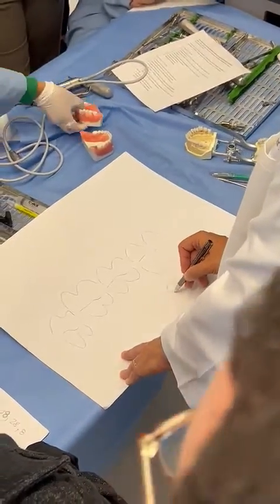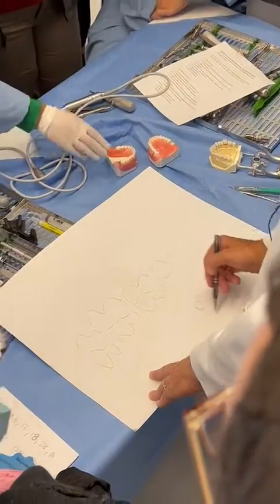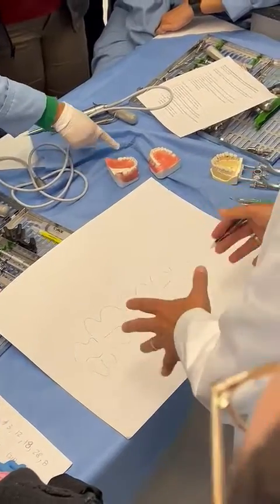What's right here? The second premolar. You've got the mental foramen. I don't want you cutting that like that. And there are other vital structures.